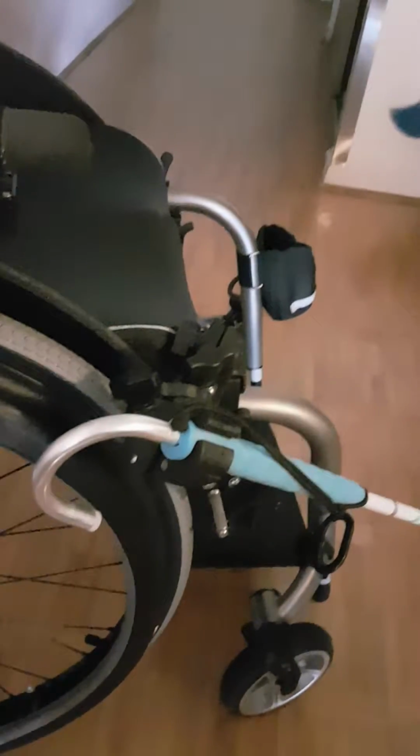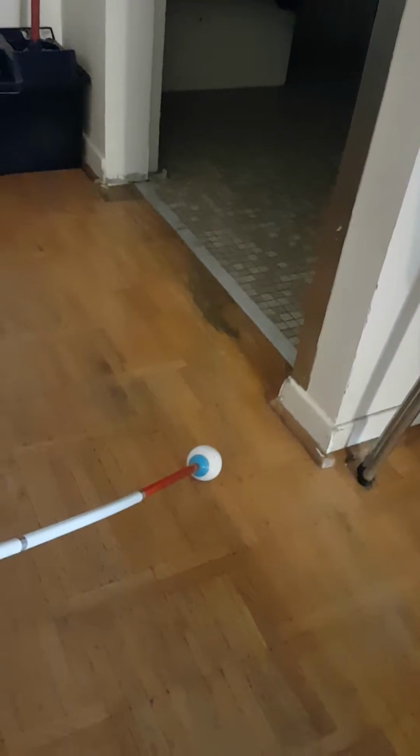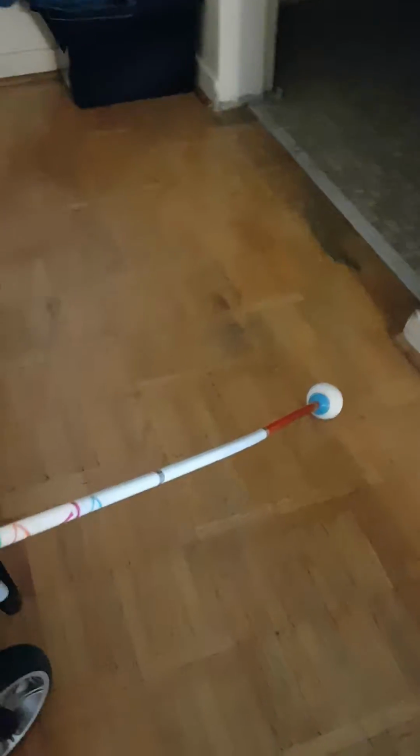Okay, so first of all, the cane I have is pretty specific. It's an Ambutech crook-handled cane. There's the crook handle, and there's the rest of the cane, and it's got a rolling ball on the end. That's so that it doesn't get caught in cracks easily. And it's also so that when I swivel it back and forth, that ball rolls and it's much easier to push back and forth.